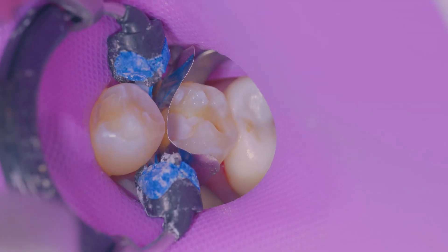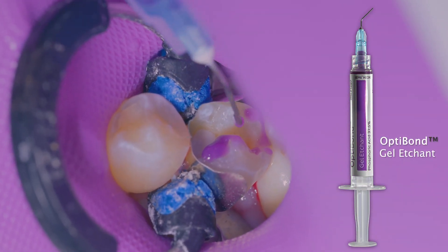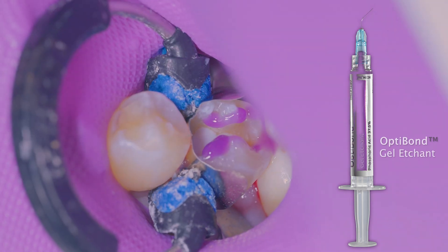Here you can see I've got tooth number 20 isolated and I'm placing a class 2 matrix. Next I like to utilize a selective etch technique on the enamel for 15 seconds, and here I'm using the OptiBond gel etchant.